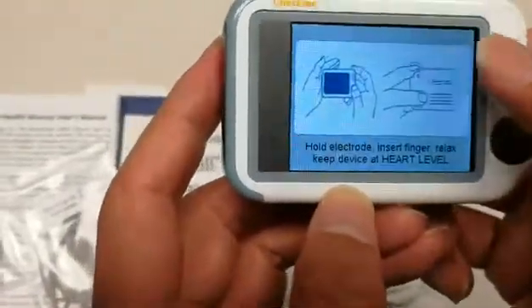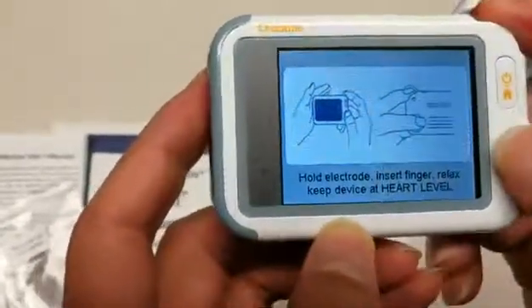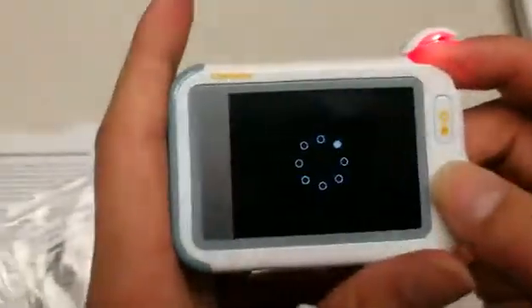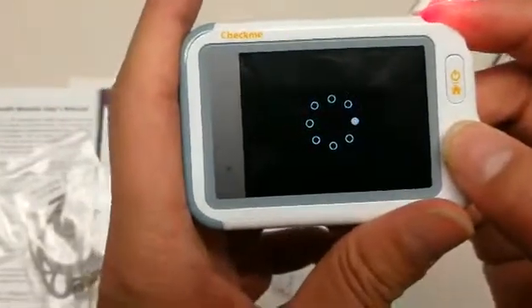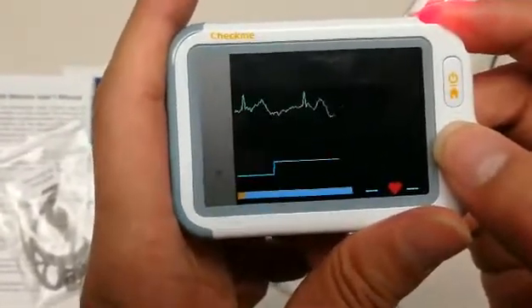Daily check will be a combination of your ECG levels as well as your SPO2 level, and once calibrated, your blood pressure level as well.